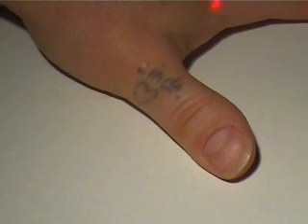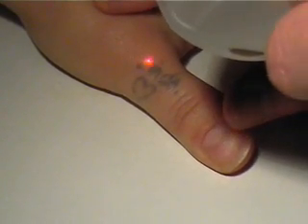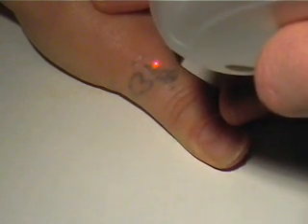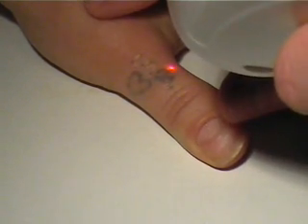As in all new patients, we fire a couple of test shots. This is to allow the patient to experience the sensation before the full treatment begins. Due to steam bubble formation around the ink particles, a whitening immediately appears over the treated area.